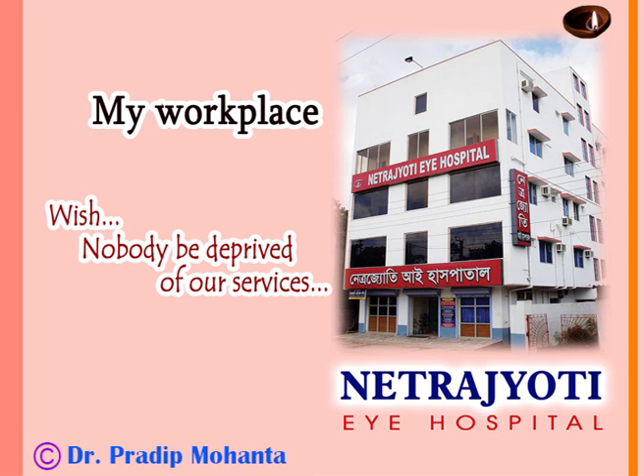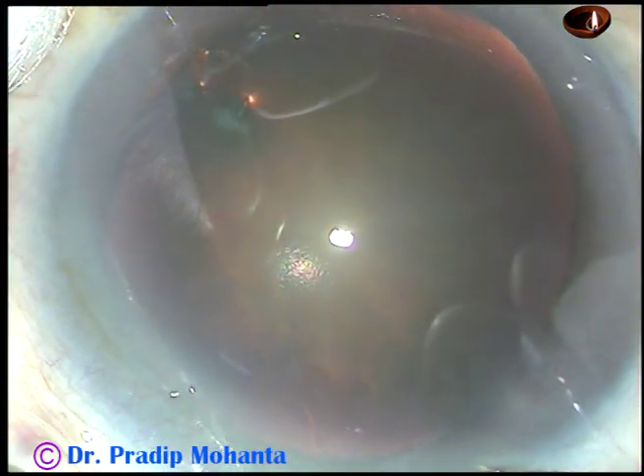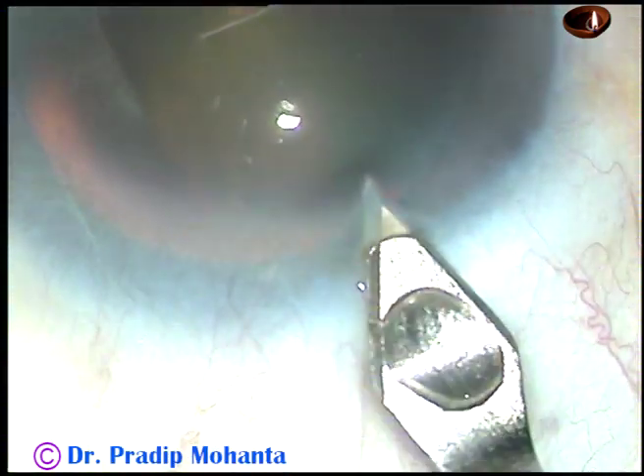Friends, welcome to my workplace at Rana Ghat, West Bengal, India. This is phacoemulsification of a posterior subcapsular cataract. This is a totally unedited recording, and you are going to watch each and every step of this surgery.